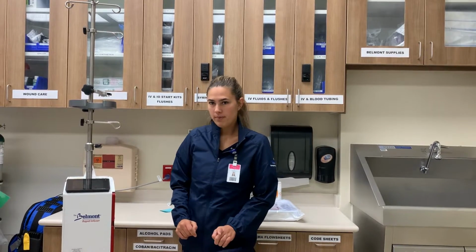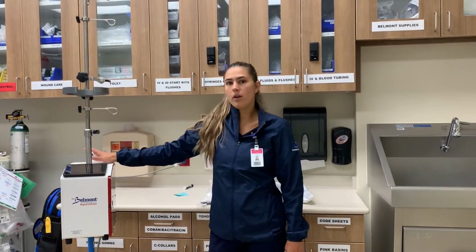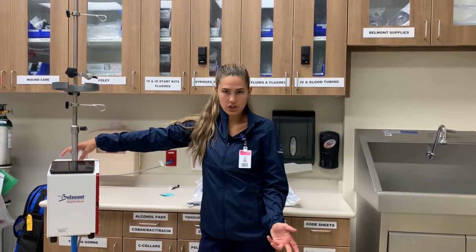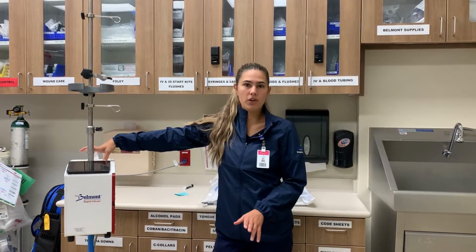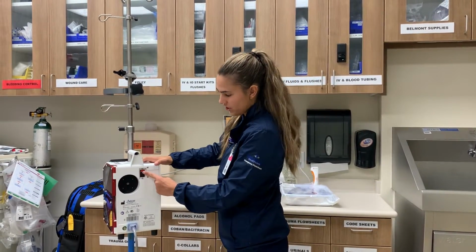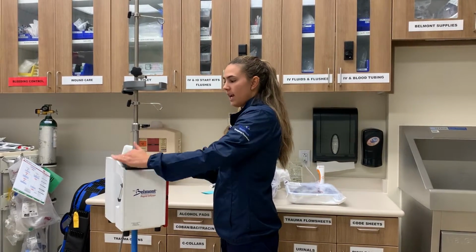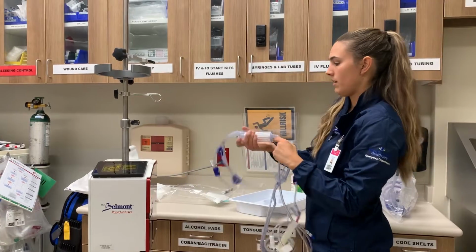Okay, the first step you want to do is plug the Belmont in. The Belmont will work if it's not plugged in and has been pre-charged. However, it will only infuse 50 milliliters per minute and it will not warm the fluid. If you turn it around to the back, you can see the switch right here. You're going to switch it to on and you'll see the screen lighting up. Now I'm going to open the tube.